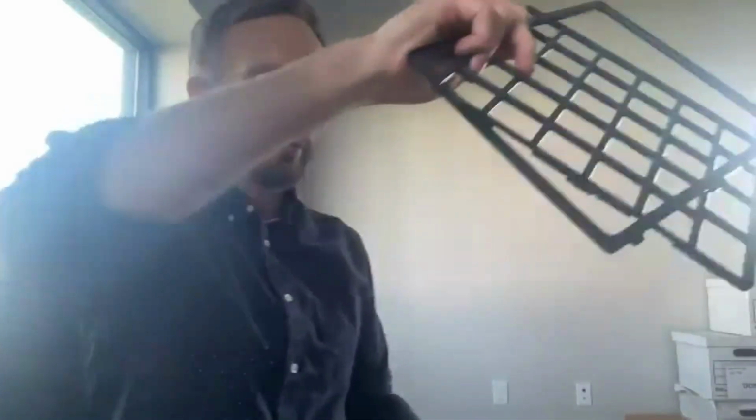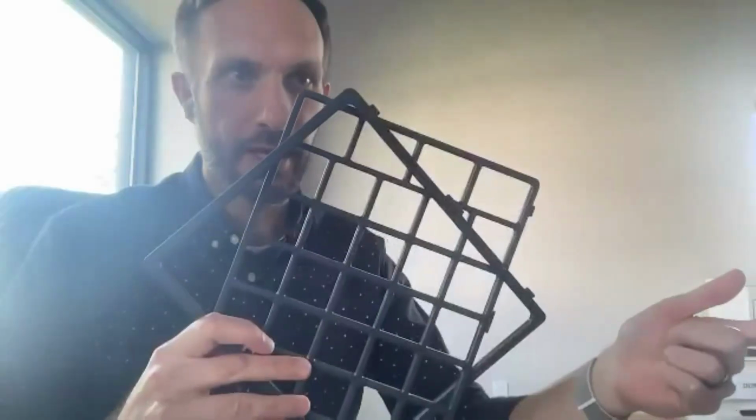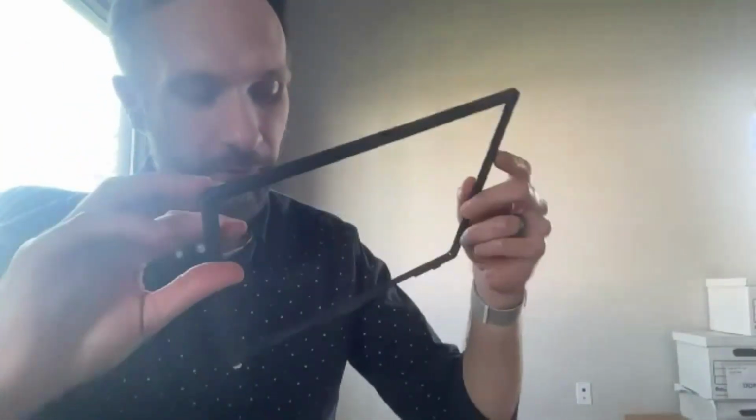And another one of the super cool things. The GoTalk Connect comes with 3 different grids. We were just looking at the 9 with 3 core messages. This is a 25 grid with 5 core messages. And then we have this one. This big empty one is for visual scene displays.